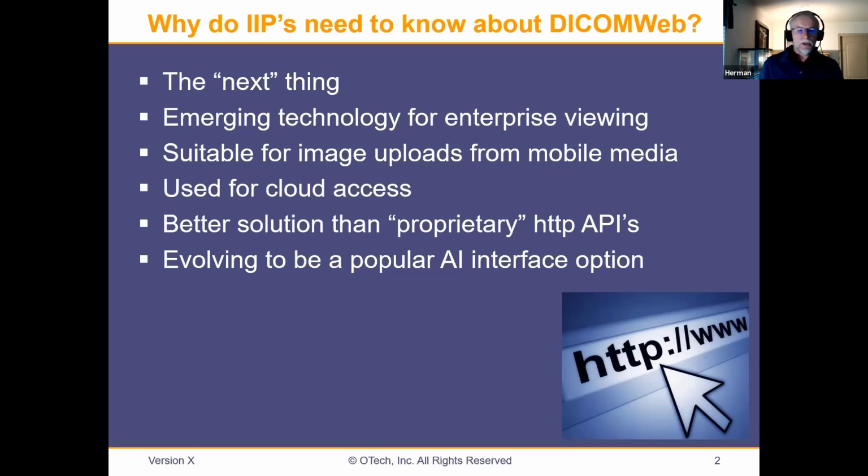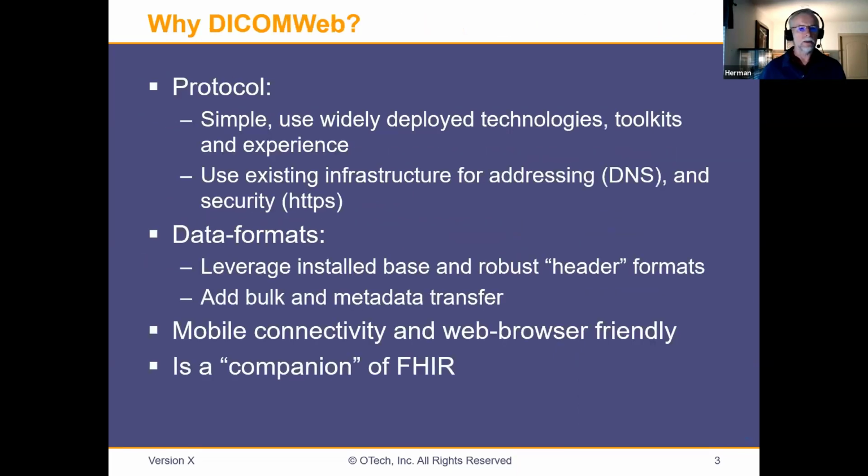And it's evolving to be a popular AI interface option, right? If you have an AI algorithm running in the cloud, DICOMweb will be the solution to either upload or download the images with results. So that's kind of why you need to know about it.